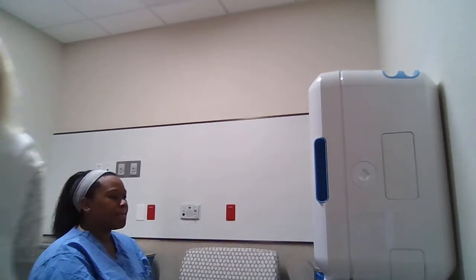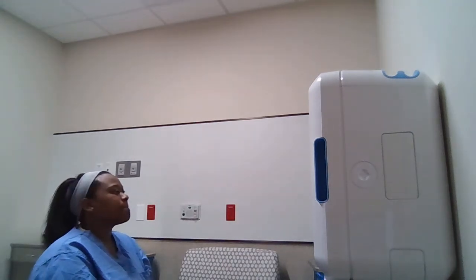Alright, I have to turn down the light now for our ophthalmoscope exam. I'm going to turn that off here once I get my light on. Okay, we okay like this? Mm-hmm. Might be a little too dark. Okay, I'm just going to check for a red reflex first. Try to look at my nose beyond the light if you can, so it doesn't hurt you.